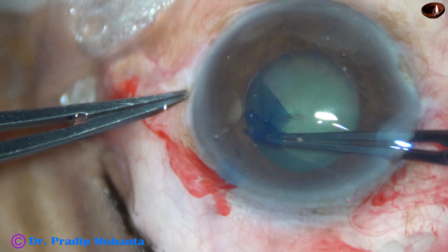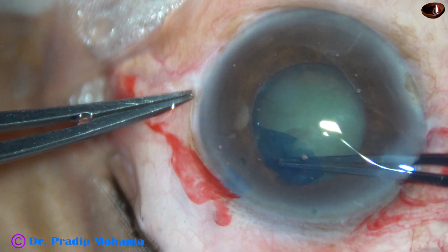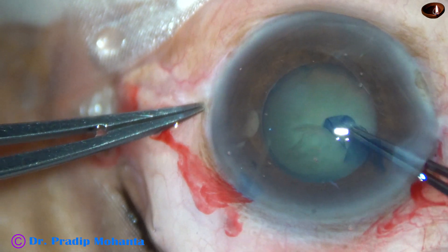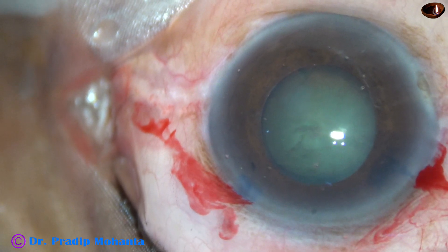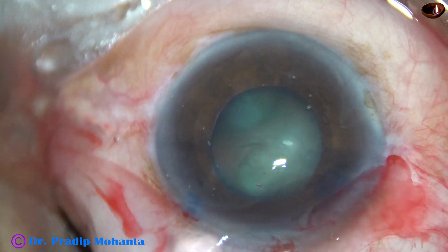I am doing the rhexis very gently — no jerky movement, slow and steady movement. And I have got an adequate-sized rhexis of about 4.75 mm.